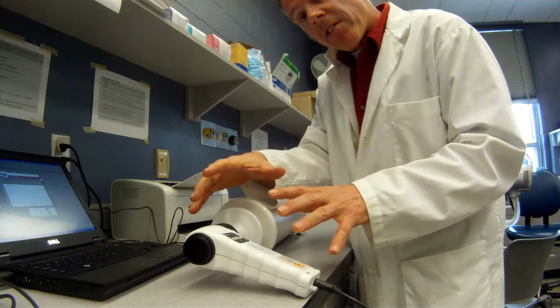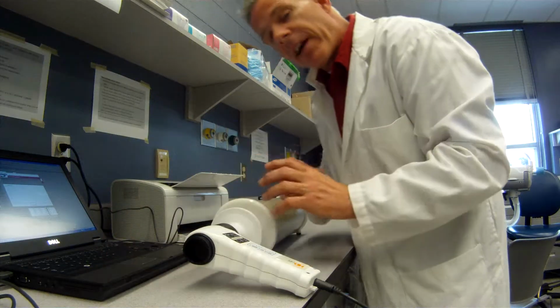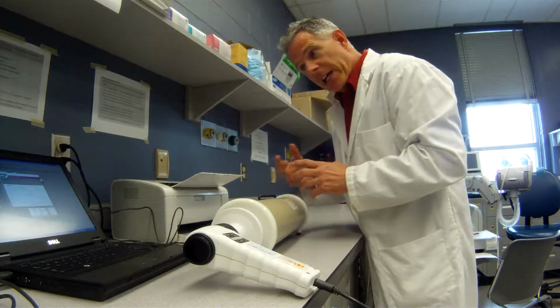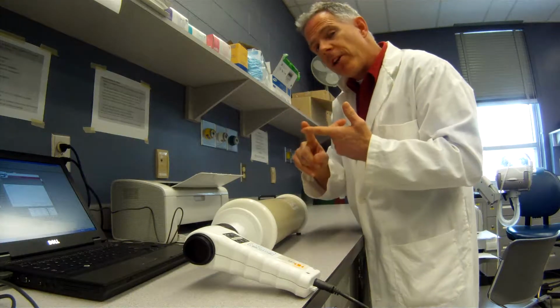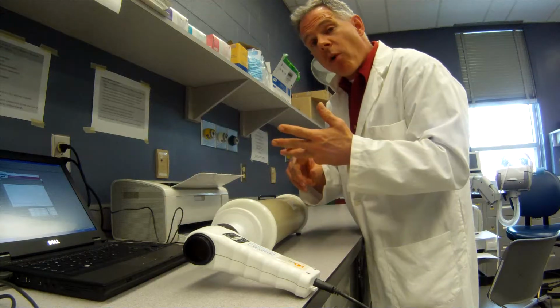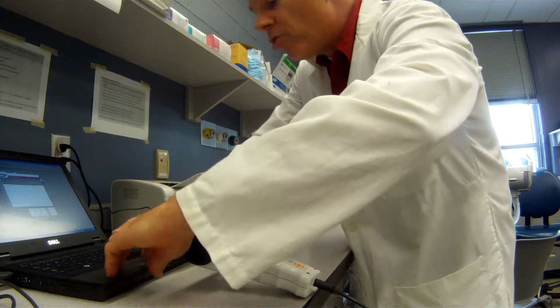We've calibrated our device, and now we're going to do a verification to make sure it's working correctly. Now this is where you need to know a little bit about the American Thoracic Society guidelines, because it wants to make sure that we verify it for 3 flow rates: a low, which is about 1 liter per second, a medium flow rate of about 5 liters per second, and a high flow rate of about 10 liters per second. Now it doesn't tell you this in the software, you just have to know that.